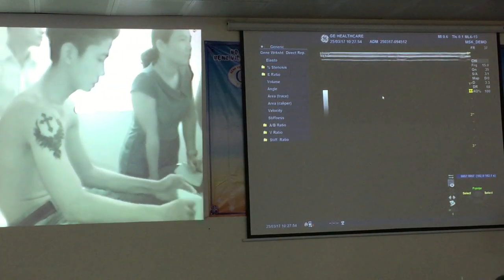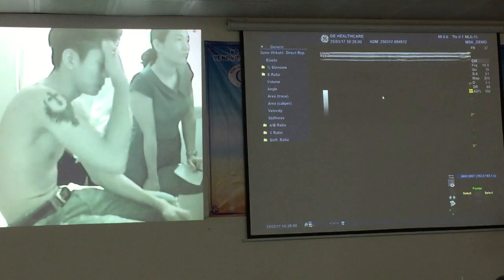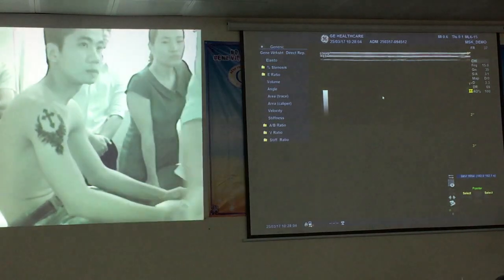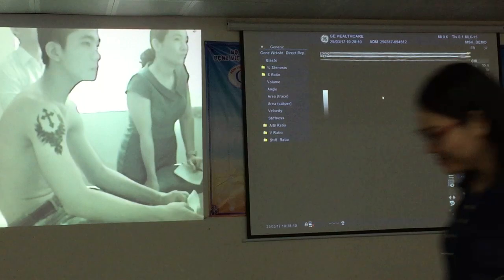Please do the scan of the axillary pouch on the ultrasound, to scan the inferior glenohumeral ligament. To look at the inferior glenohumeral ligament, you just ask the patient to go into that stop sign.